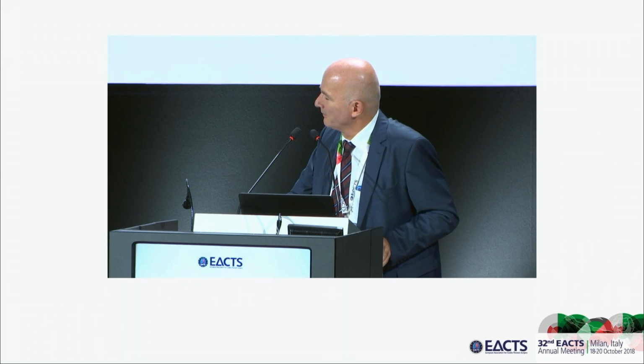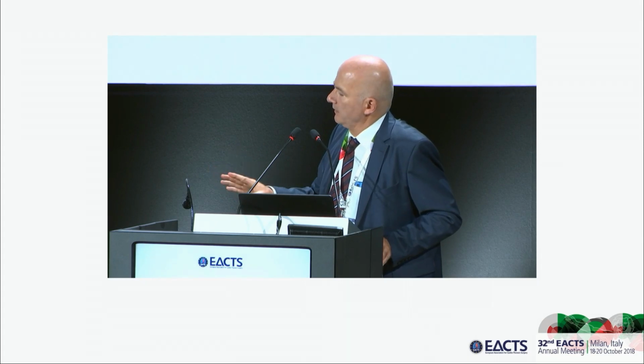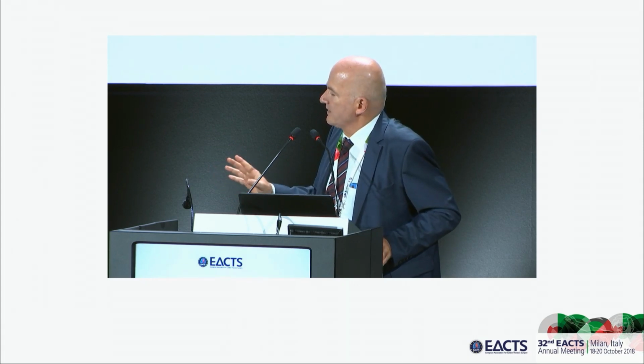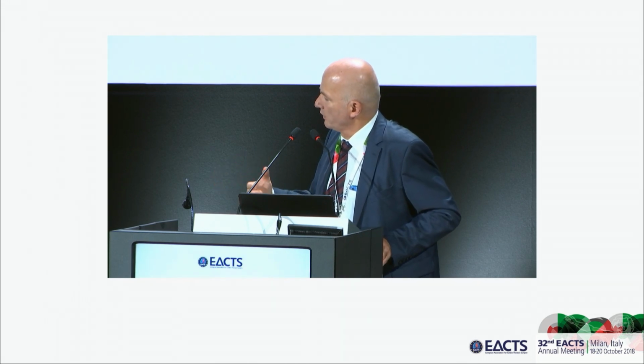So question, right now, if you have a 27 or less millimeter annulus for isolated bicuspid valve repair, are you putting in a ring? No. Yeah. But, and there comes again another, I have to be honest with you, I don't either sometimes. As Paracelsus said a couple of thousand years ago regarding medication, there is no effective medication without side effects. There is no effective procedure without potential complications. This is why I think a prophylactic annuloplasty is maybe difficult to argue.